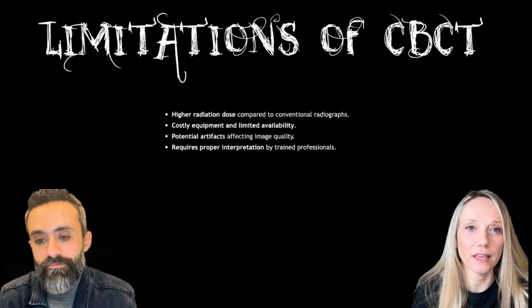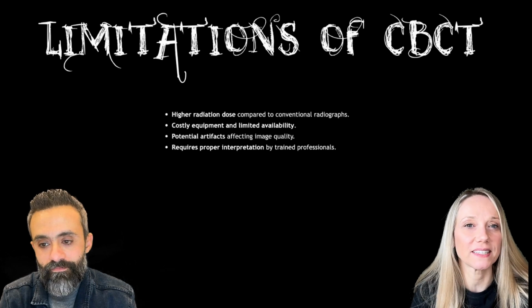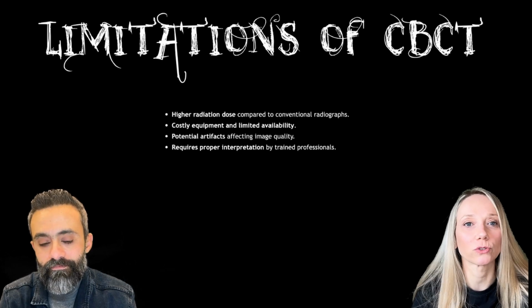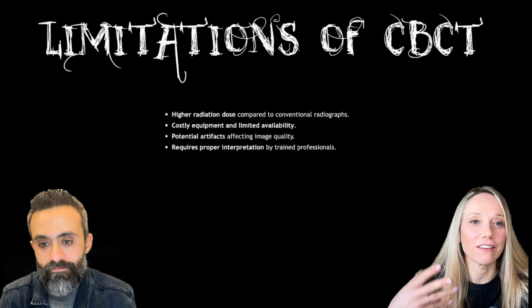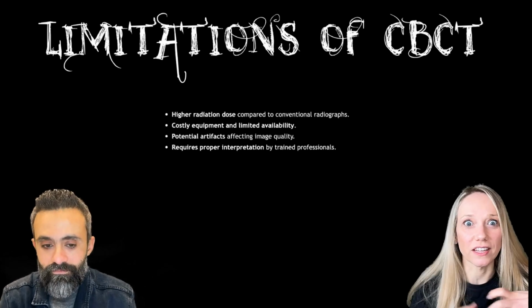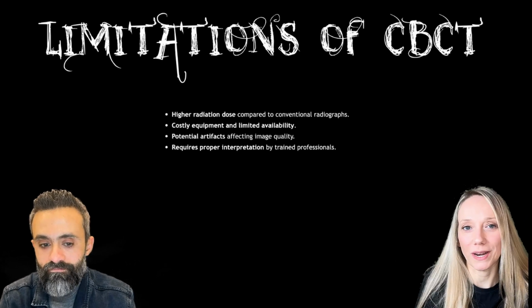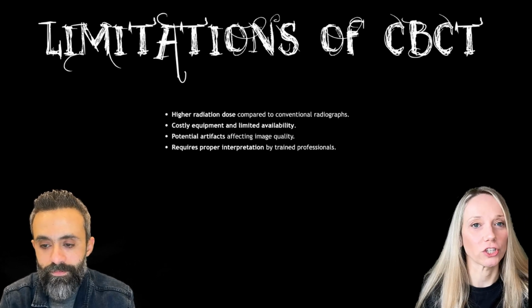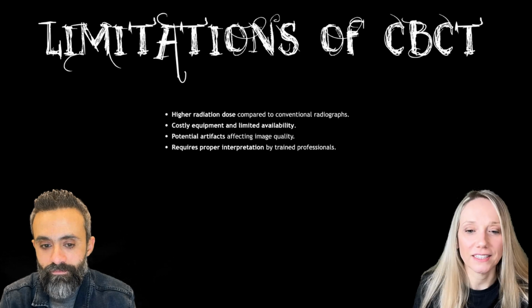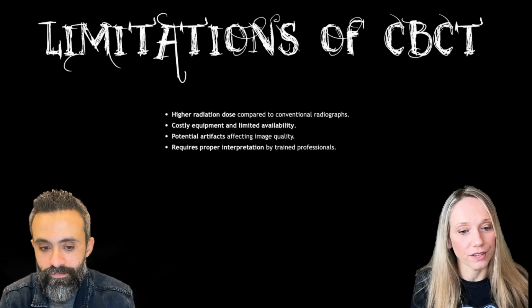But let's think about what we had to do in the pre-CBCT era. Maybe we had to take 3, 4, 5, 6 different angulated X-rays in order to guess what the problem was. Nowadays, with just one image, a CBCT, we have all the information. So I think that yes, it gives a higher radiation dose, but it's completely worth it.